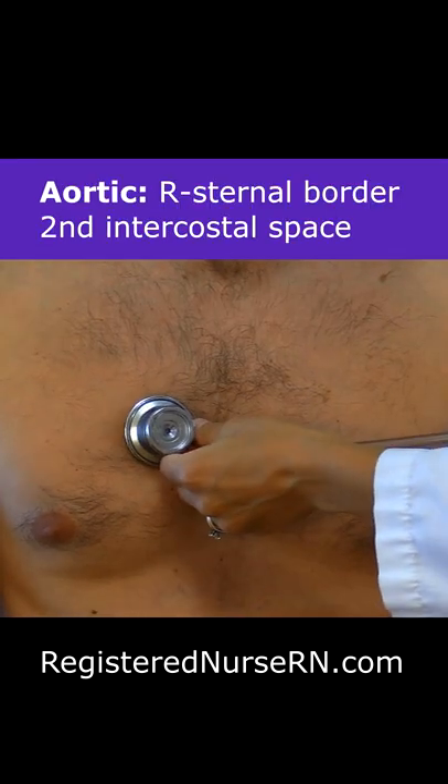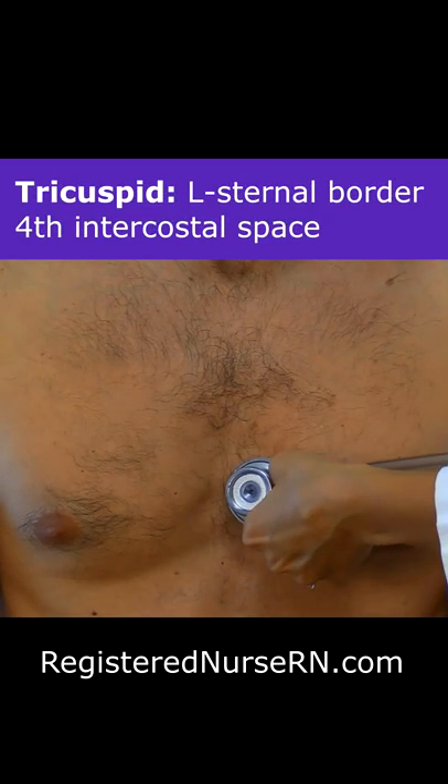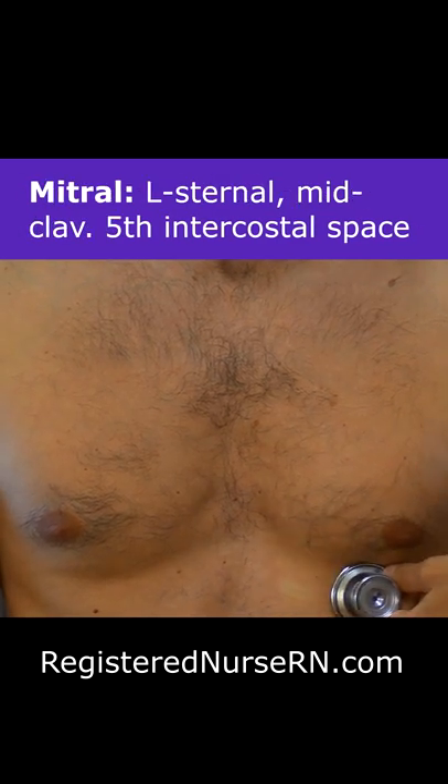Aortic over here. Then I'm just going to inch over here to the pulmonic, inch down to Erb's point, now inch down to the tricuspid, and then go over to the mitral area.